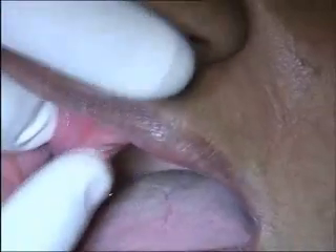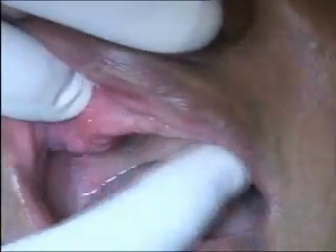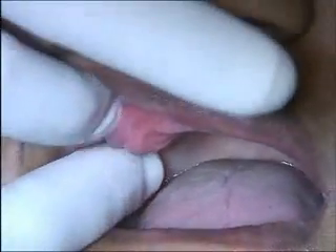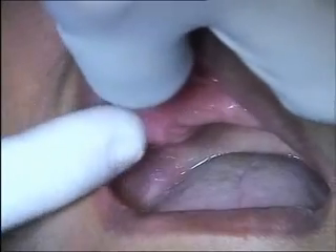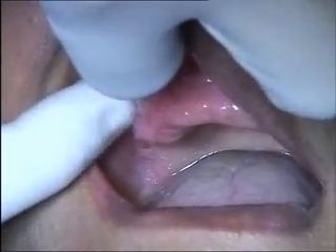The patient had a lot of periodontal involvement for a long time, and then a total extraction was done. The flange of the denture has caused folds and folds of soft tissue — the flange is cutting into the soft tissue, creating a soft flabby bridge.